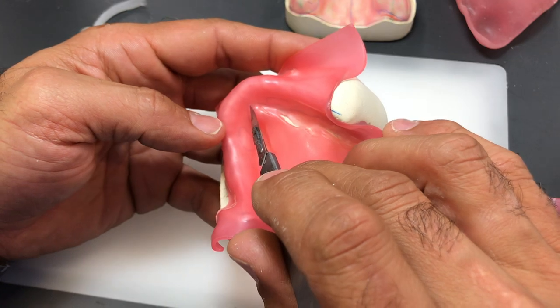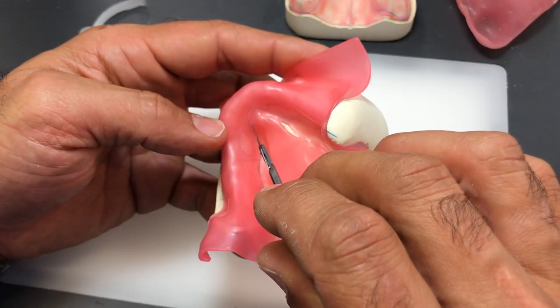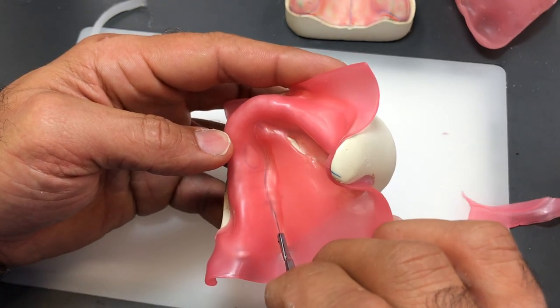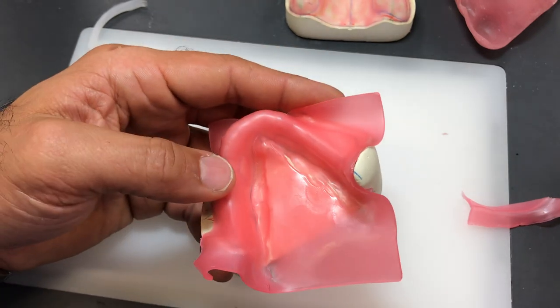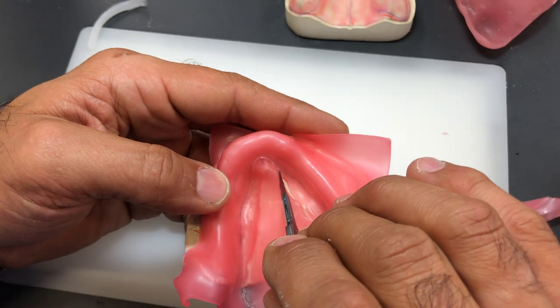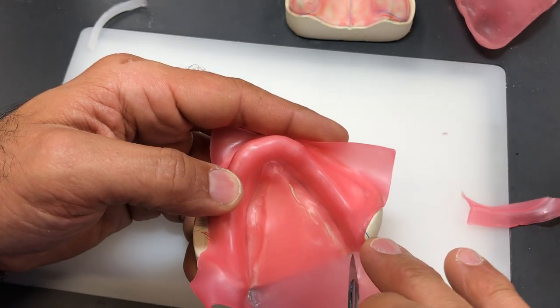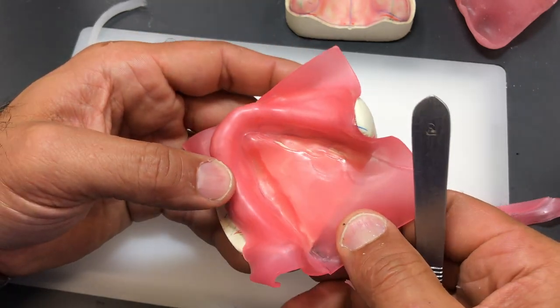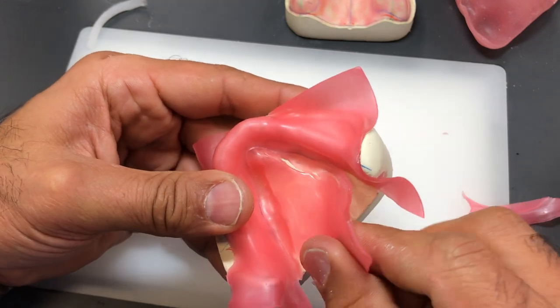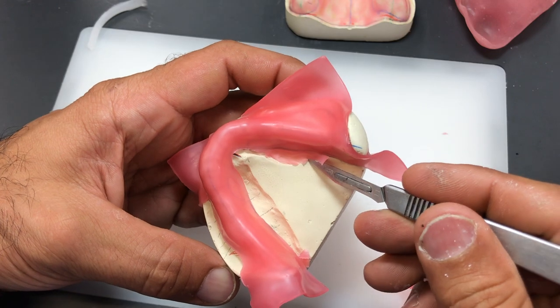And again, it really doesn't make a difference where you start and where you finish. I'm going to cut out the inside, holding the blade at right angles to the surface of the cast. And I'll pull this out. If you have room in your wax cup, you can utilize this wax. Don't waste it.